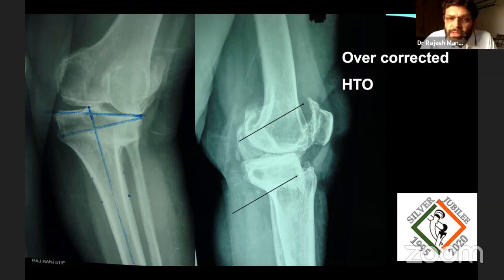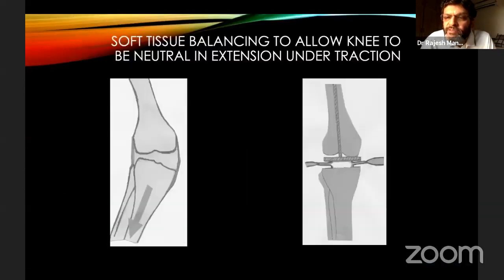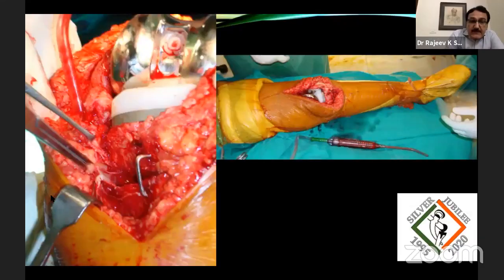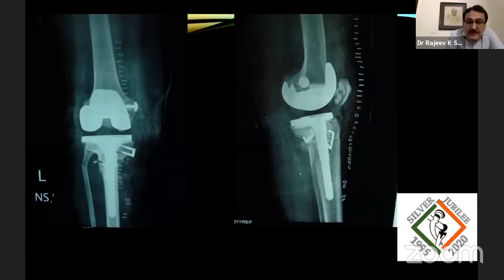So one last question, that stem that you put, if you can go back to that X-ray, because you're almost always worried about the stability of the distal fragment just with the stem. Yes. Go to the post-op X-ray, sorry. But you see, Rajesh, if you are able to have a good purchase in the tibial cortices, then it is not a major issue.